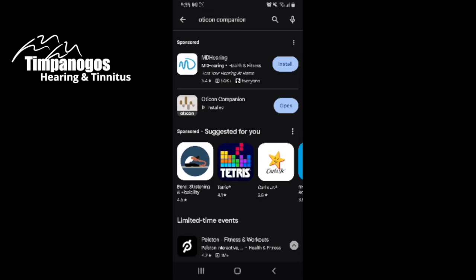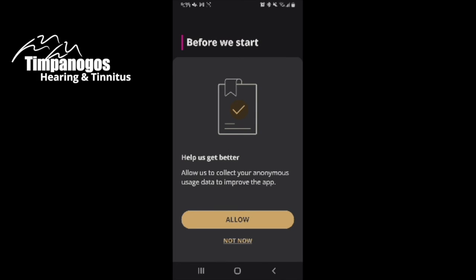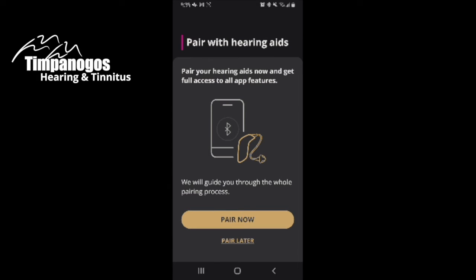Great, so it has been installed. I'm going to open that. It's going to walk me through and ask me some questions. I'm going to go ahead and hit Allow. And yes, I do want to pair this with my hearing aids, so pair now.